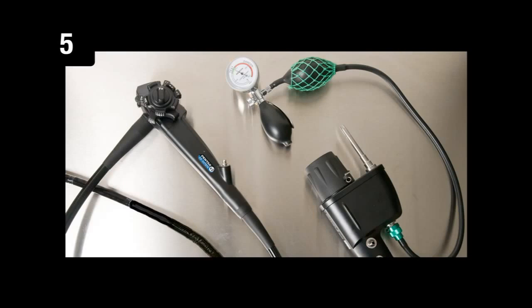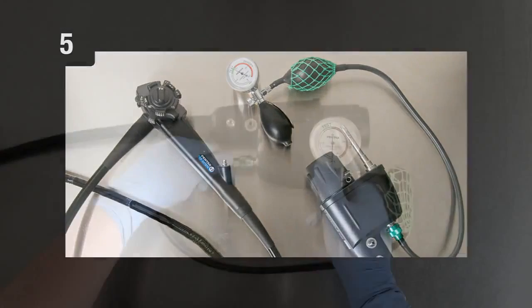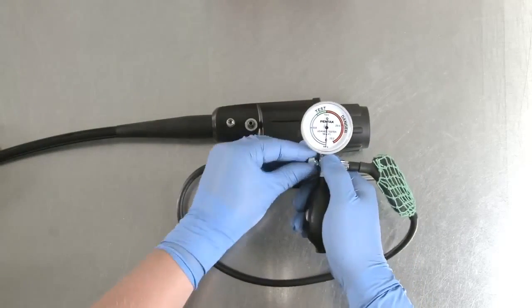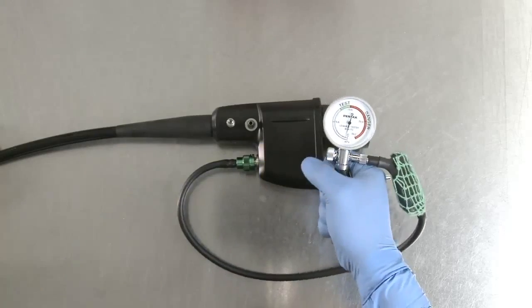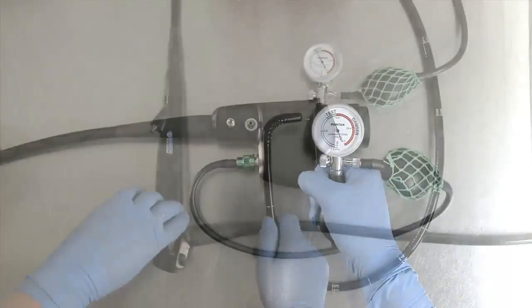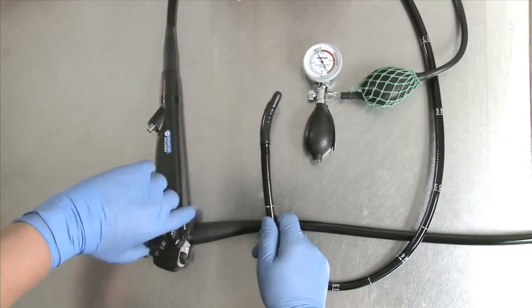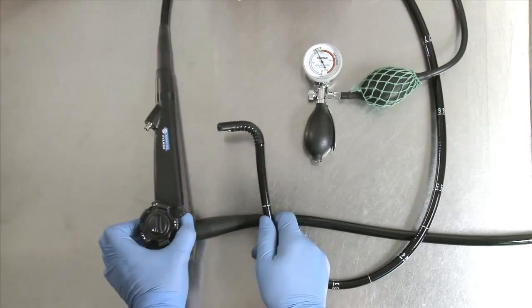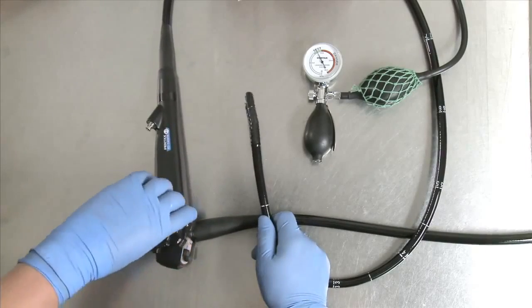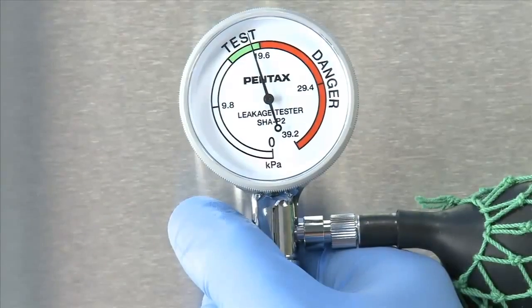Step 5. Perform the dry leak test. Attach the leakage tester to the venting connector and close the pressure relief valve. Pressurize the endoscope until the needle on the gauge moves into the green zone. Ensure that the control knob locks are in a free-moving position or unlocked, and deflect the distal tip in all directions. Observe the leakage tester gauge.